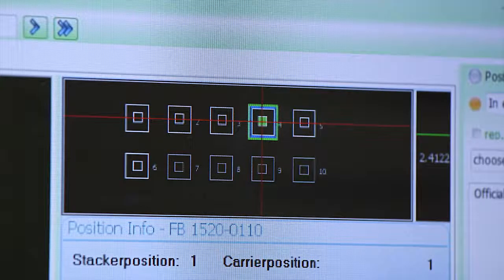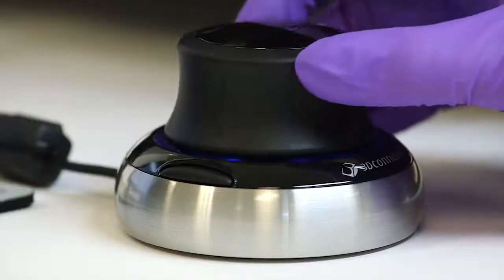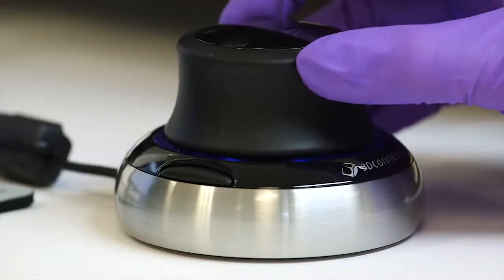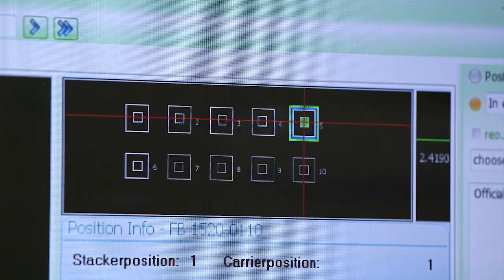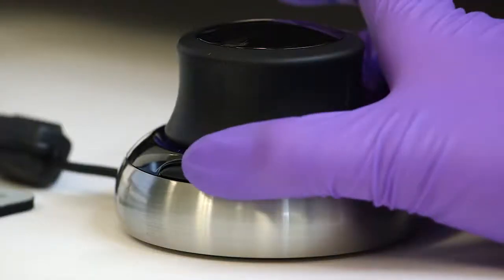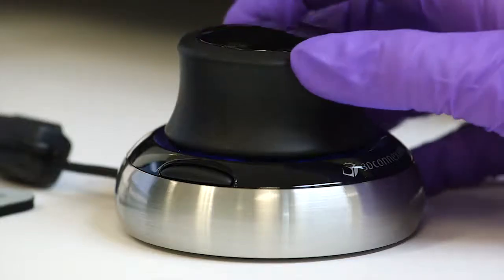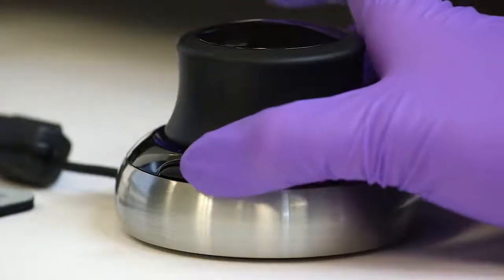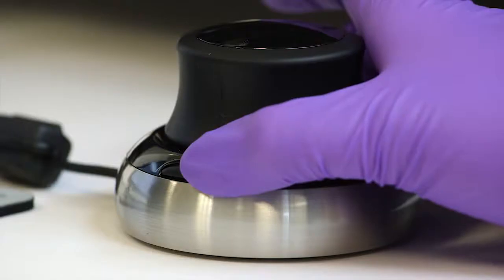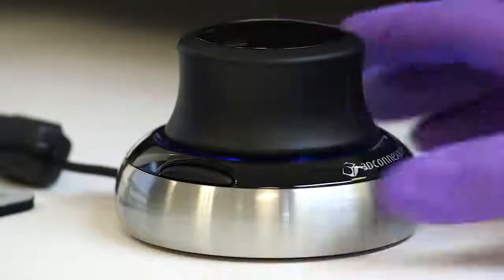If additional images are required, fluorescence images can be recorded manually using the 3D mouse. When the desired image section is selected, press Enter to capture the image. The photograph is captured, saved, and forwarded to Europattern for pattern recognition. Additionally, click the left or right button to move one well to the left or one well to the right.